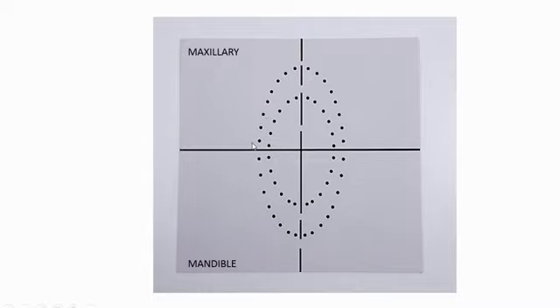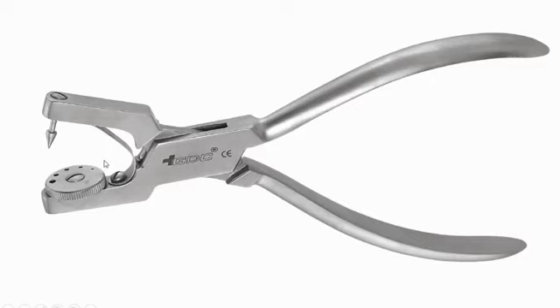तो अब आपको सिंपल वे में पता चल गया है, और जब आप रबर डैम किट लेंगे उसमें आपको गाइडलाइंस में लिखा होगा कौन सा टूथ के लिए कौन सा होल करना है. और सिंपली मैंने आपको बताया: lower incisors, upper incisors, canines and premolars, larger diameter premolars or smaller diameter molars, and especially larger molars like first maxillary and first mandibular molar. तो आपको पता चल गया कौन से होल से क्या करना है. Just put the sheet and press it in one go.